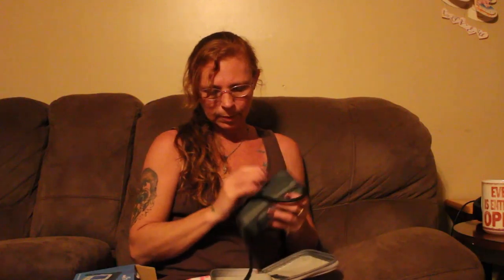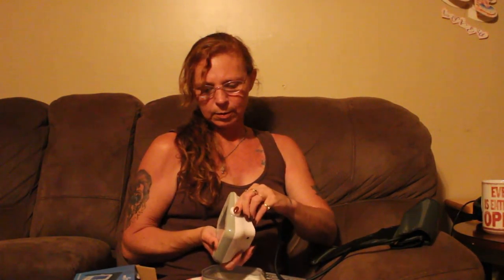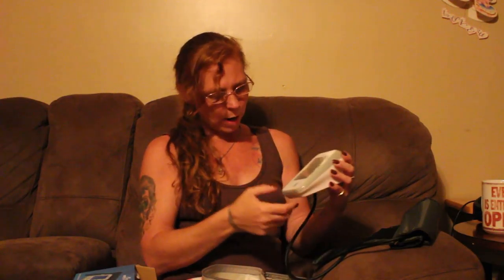This is very easy to use. Take this out and plug it in the side right here. And then you have the set button, where you can set your time and stuff. And then you have start and stop. And then you have the menu button — it will give you your blood pressure and your pulse.